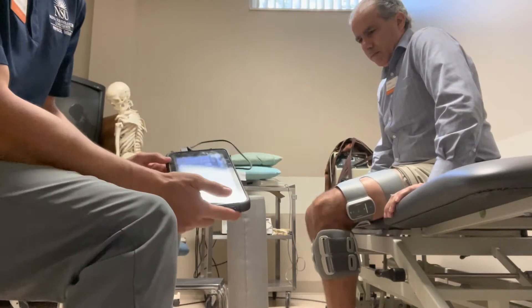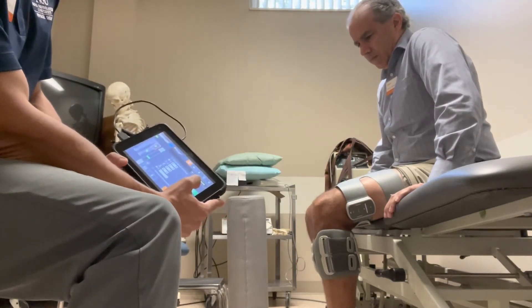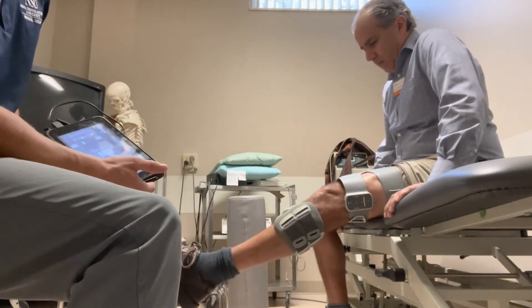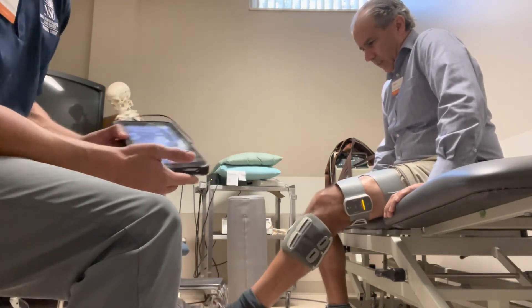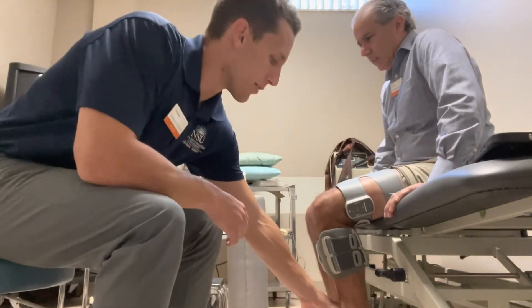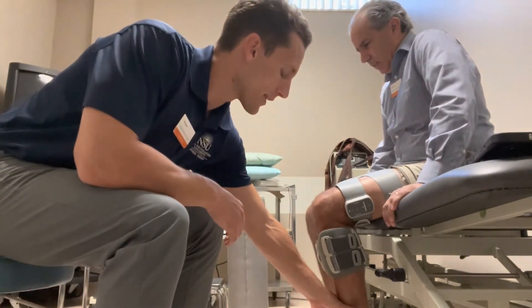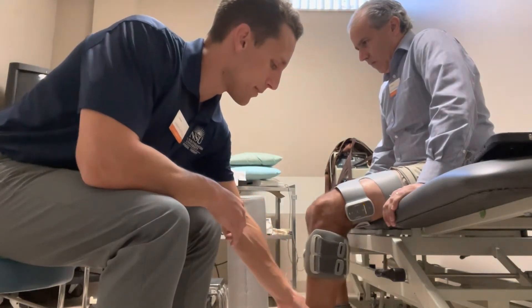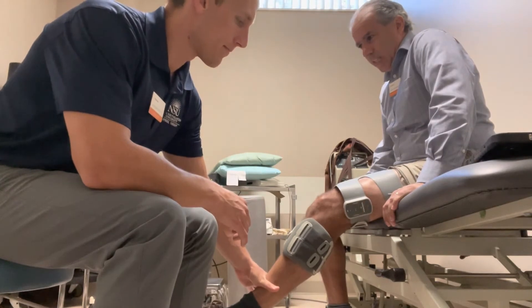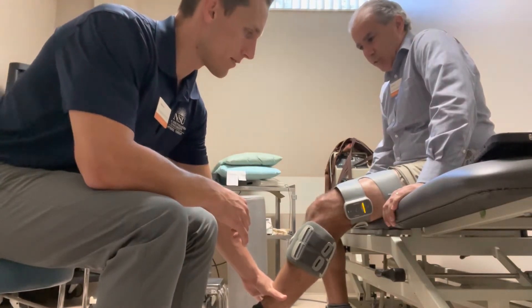Now in sitting position, we're going to do a long arc quad first. If the patient is ready for a little more, we can go to manual resistance — so next time it kicks on, push into my hand. We can do isometrics and hold, then eccentrics, pushing right back.